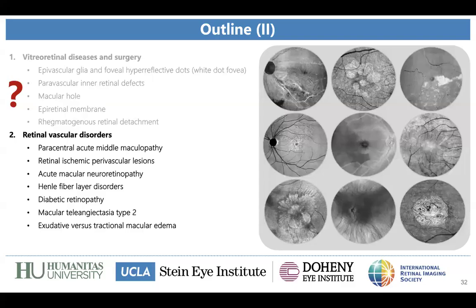And as I showed you also in the context of a epiretinal membrane, where we can distinguish foveal versus extrafoveal patterns, I think the same can be done with macular holes to actually study, for example, the extent of photoreceptor recovery in a certain percentage of the hole. So I think this is a very important application, and we are not studying that, but it is a very important application.